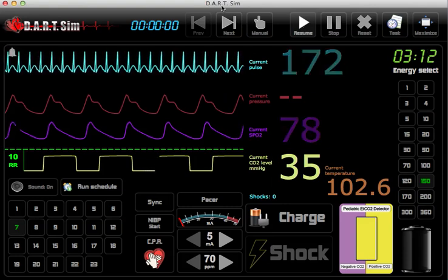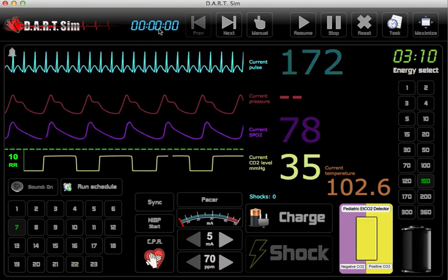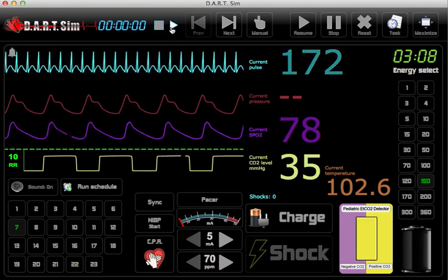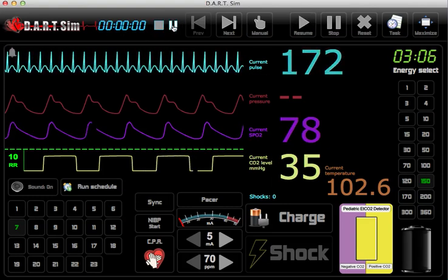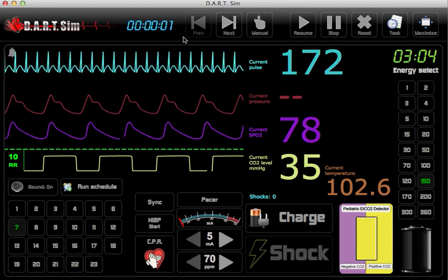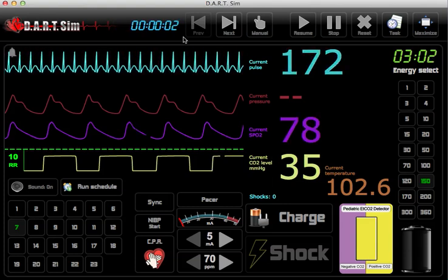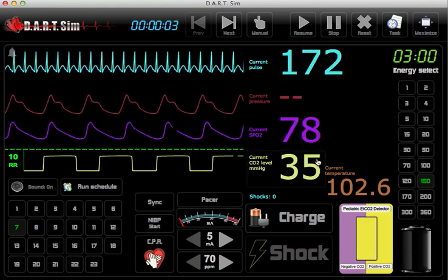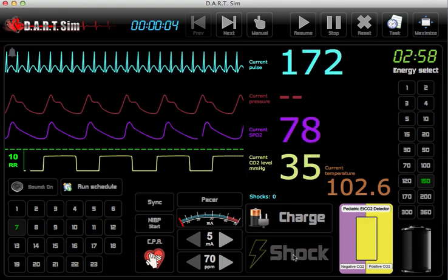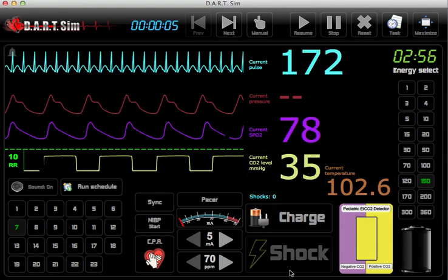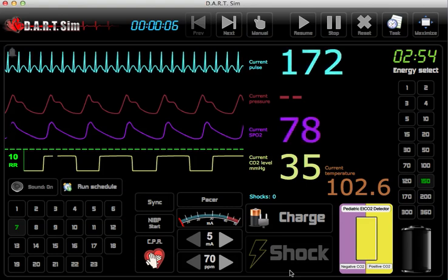We'll go ahead and start our code timer. We have a patient here with an unstable SVT.